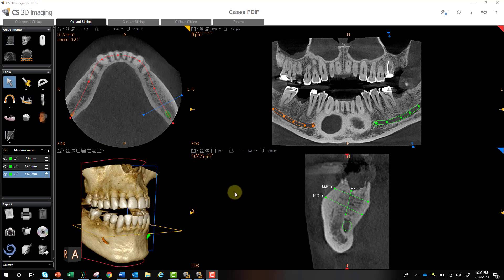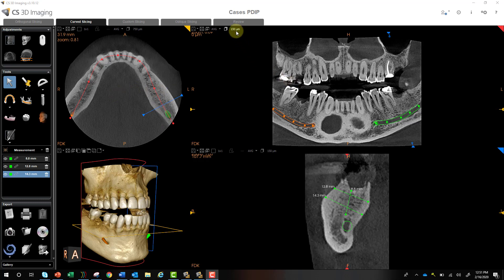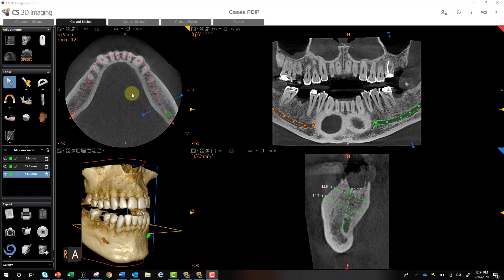Your measurements will be most accurate if you capture them in your cross-sectional view or your axial view for mesial-distal measurements. The panoramic curve measurements will be pretty close, but because this view is created from how you draw your curve — and you can change the slice thickness — it can affect accuracy. Use your cross-sectional views for buccolingual and height dimensions, and use your axial view for mesial-distal restorative spaces and buccolingual measurements as well.